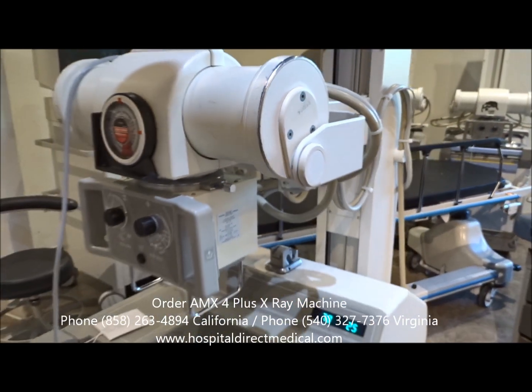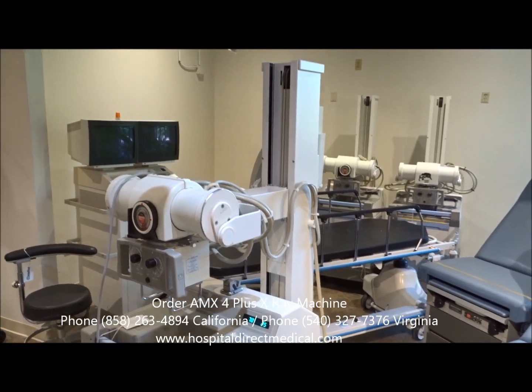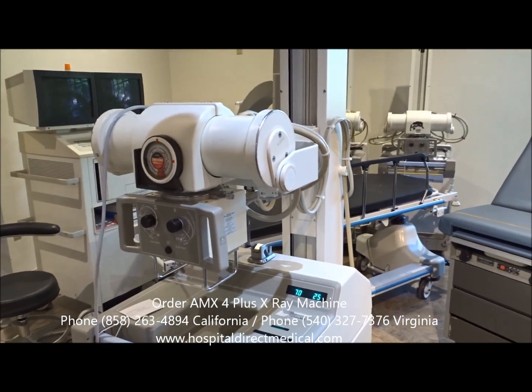We basically refurbish these machines. We're able to test the tubes, make sure they've got life on them and they're in good working order. We do sell a lot of other imaging equipment including C-arms.